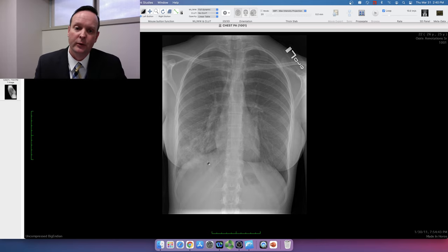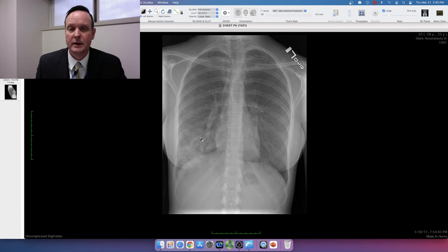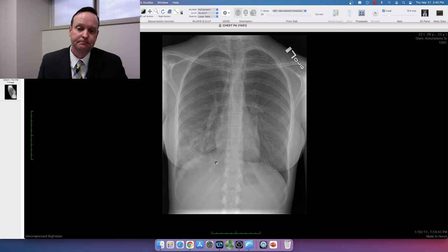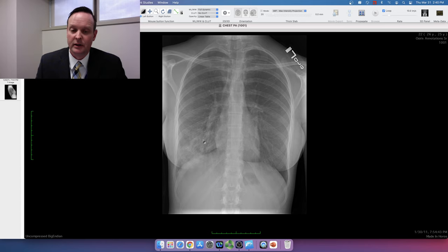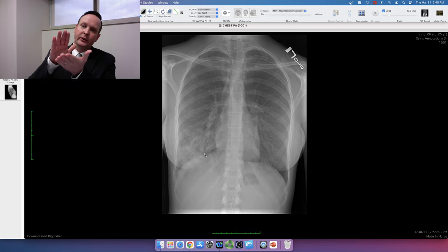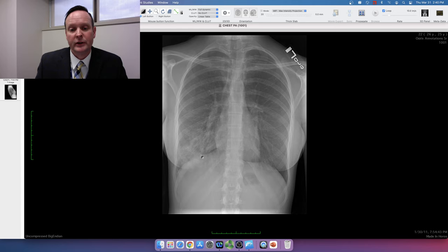There are structures throughout this area that I have to think about: the overlying breast tissue, the ribs and chest wall, the lungs, the pleural space, and potentially part of the heart. This opacity is patchy and throughout the expected area of the lung. Also, I'm losing my right hemidiaphragm — this is called the silhouette sign. When two objects of equal density are against each other, you lose the border between them.